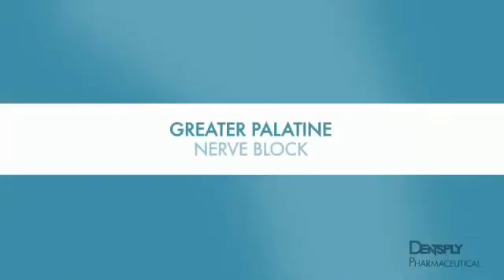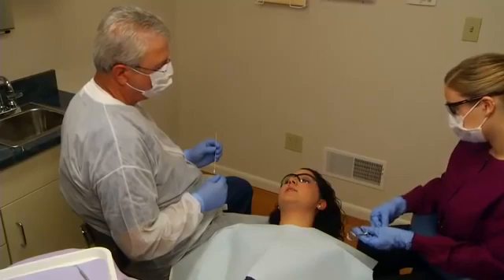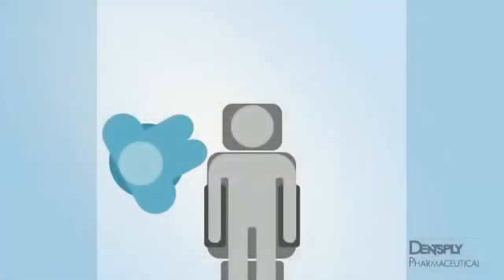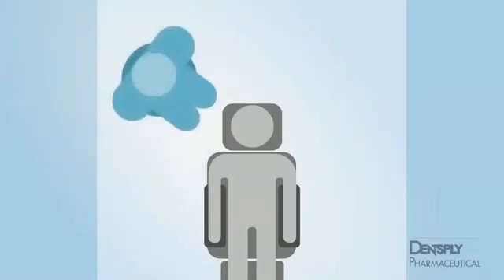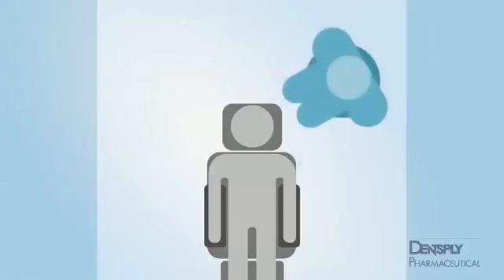Greater palatine nerve blocks are indicated for pain management of palatal soft and osseous tissues distal to the canine in one quadrant. Assume the operator position for the right-handed operator at the 8 or 9 o'clock position, or 11 o'clock position for the left side. A left-handed clinician will assume the 3 or 4 o'clock position for the right side or 1 o'clock for the left side.